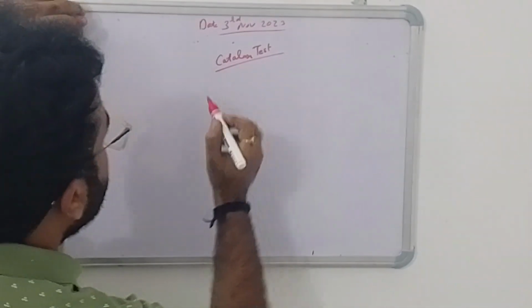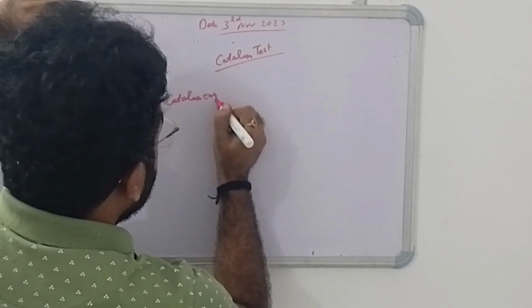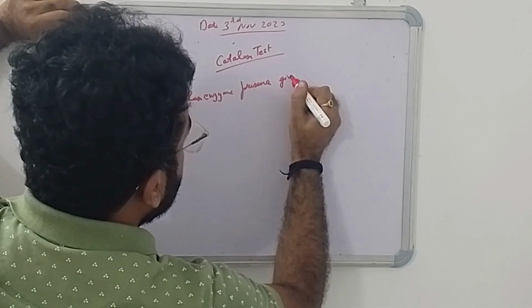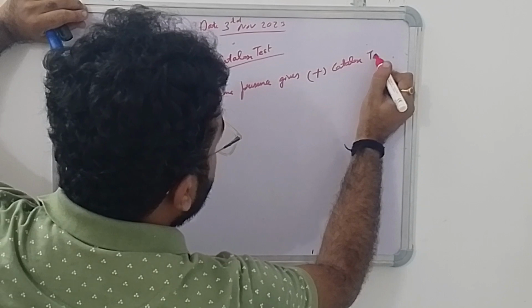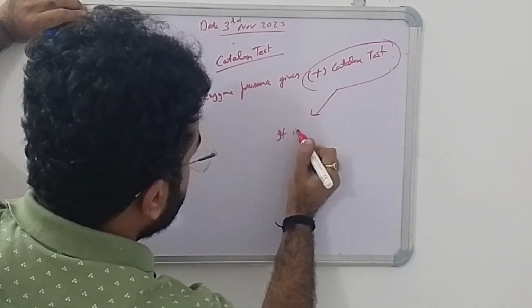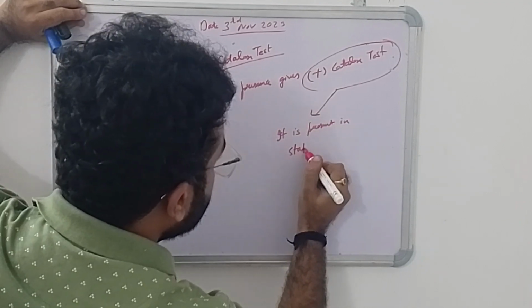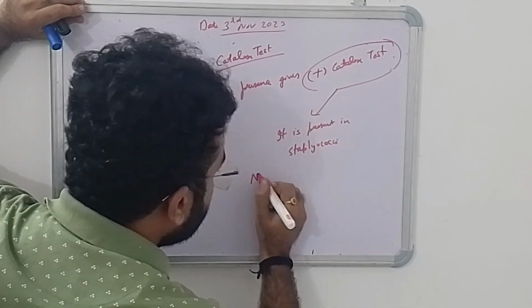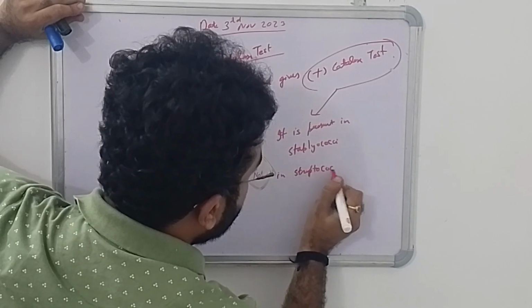So the catalase test means the presence of this catalase enzyme gives a positive catalase test, and a positive catalase test is present in staphylococci, not in streptococci.